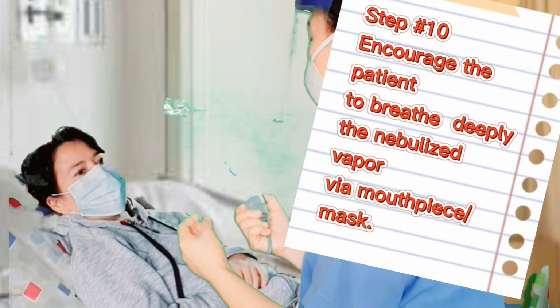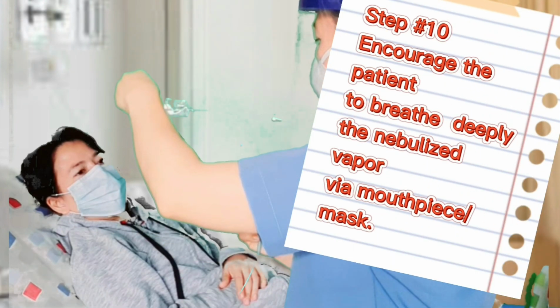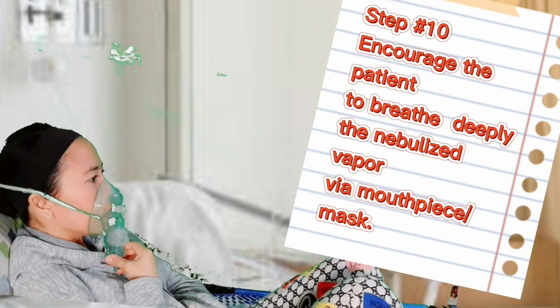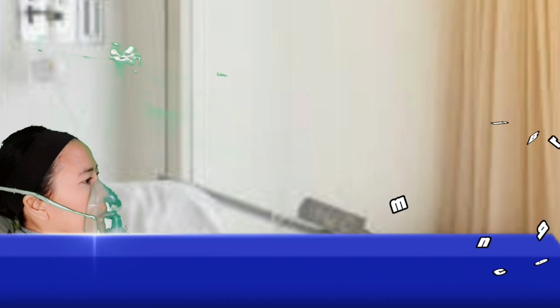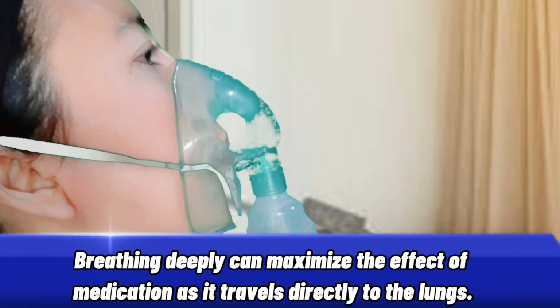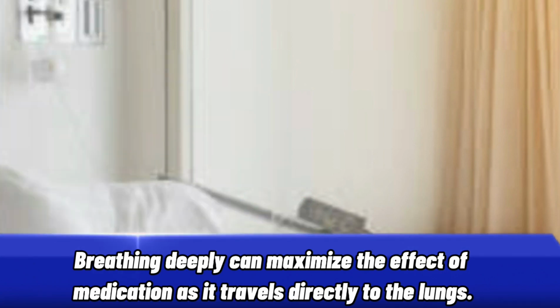Step number 10. Encourage the patient to breathe deeply the nebulized vapor via mouthpiece or mask, whichever is preferred. Breathing deeply can maximize the effect of medication as it travels directly to the lungs.